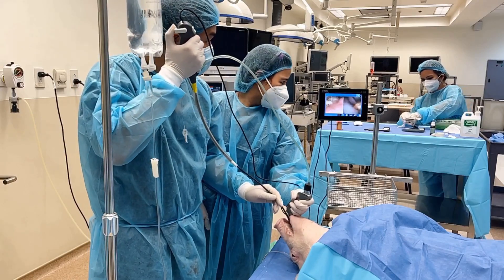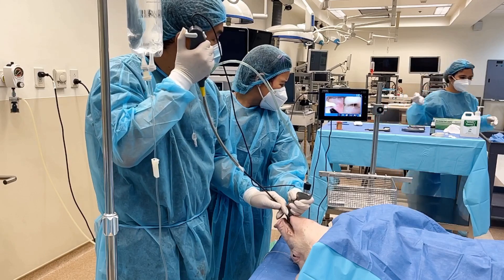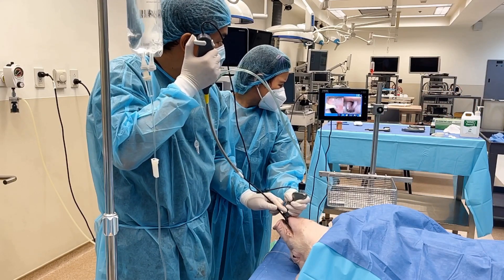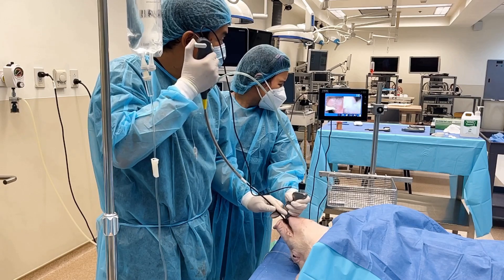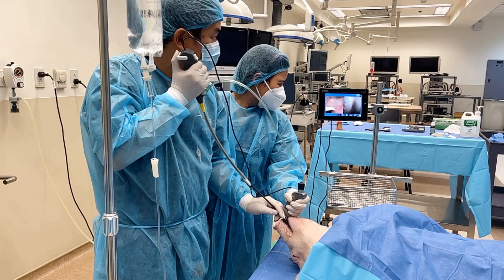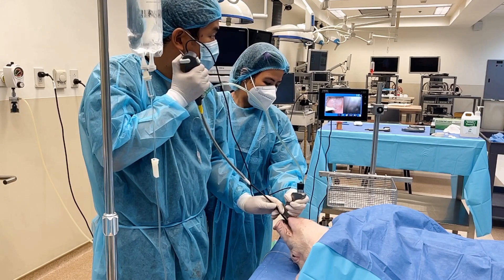Some experts suggest looking at the video laryngoscope screen and using the flexible scope as a fancy bougie. This is flexible assisted video laryngoscope intubation. If you are used to a flexible scope, you can use its view to maneuver instead.